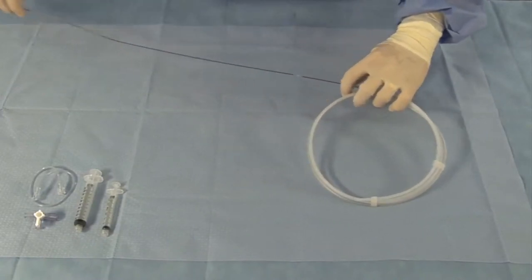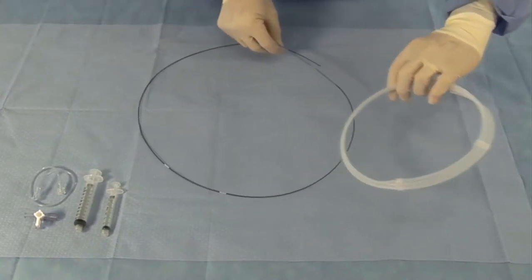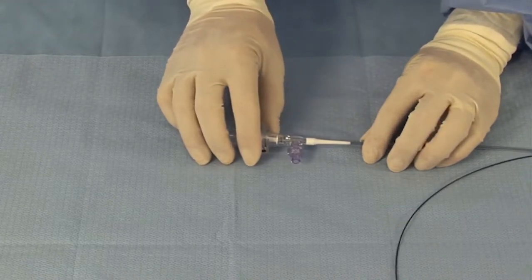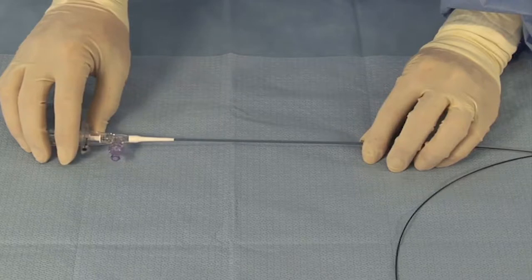Remove the catheter and components from the tray using sterile technique. Remove the packaging coil protecting the catheter. While holding the telescope hub, gently open the telescope and retract the imaging core completely to the proximal position.